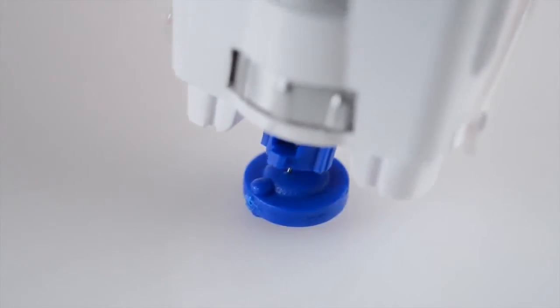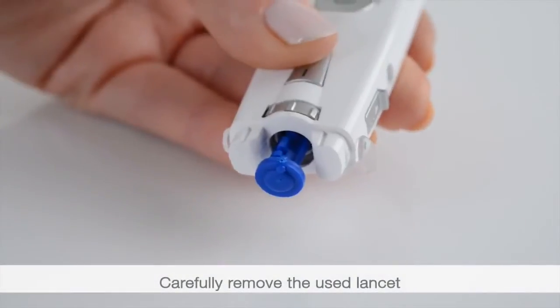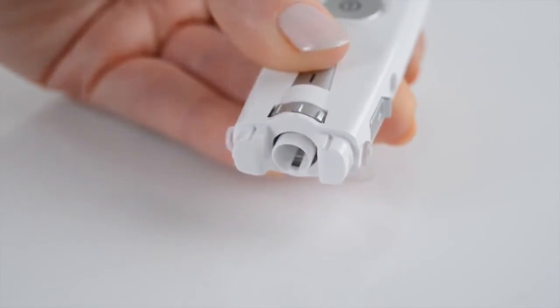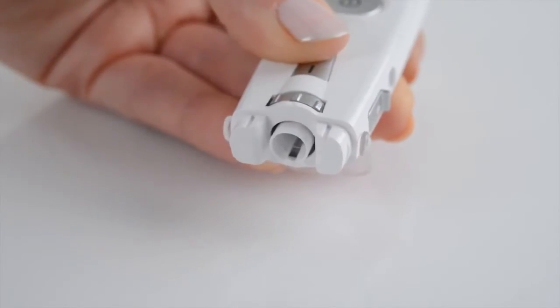Remove the cap from the lancing device. Use the tip of the needle to carefully prick the protective disc that has been removed. Press the trigger and simultaneously pull on the tensioning device. Place the protective cap back onto the lancing device.